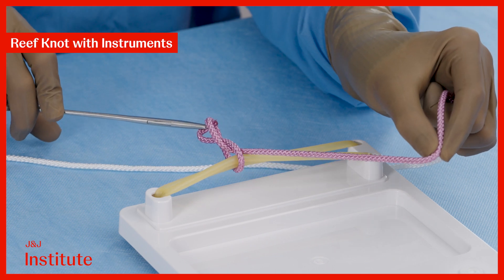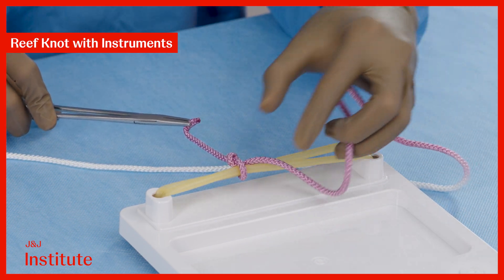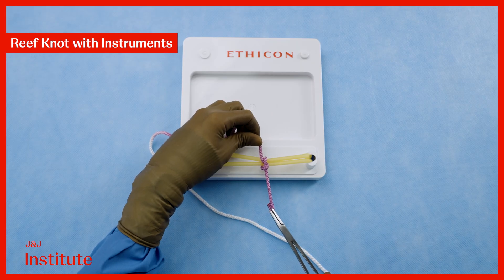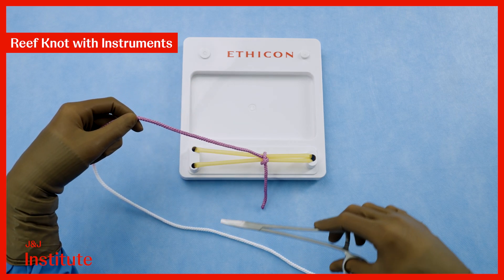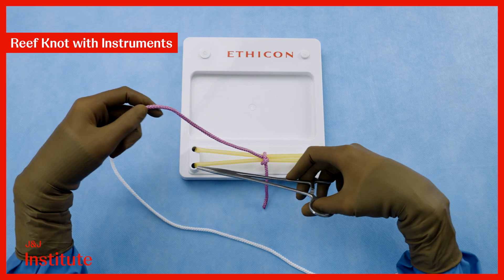Cross your hands. Crossing your hands ensures that the throw lays flat with the threads intertwining in a parallel fashion, maximizing friction and security. Once again, bring the needle driver parallel to the incision within the V and repeat the process to complete a reef knot.